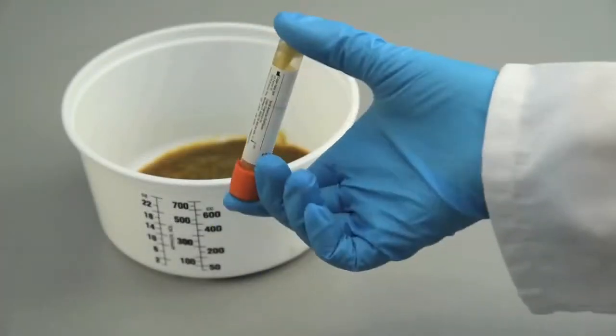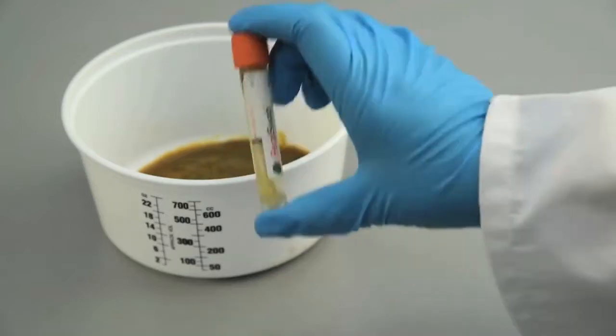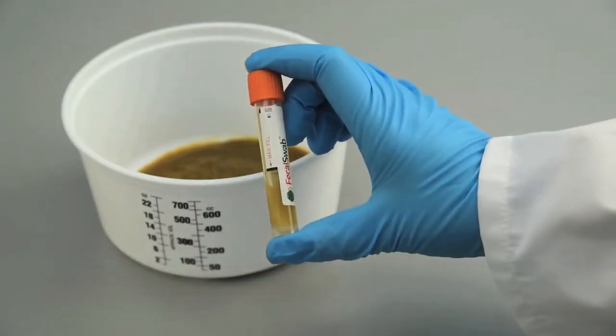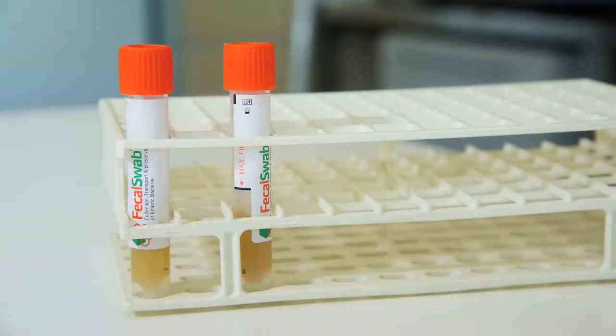Shake the vial until the sample appears homogeneous. Write patient's name and demographics on the tube or apply a label and send the sample to the laboratory.